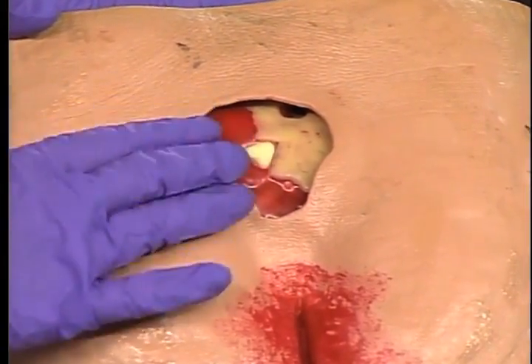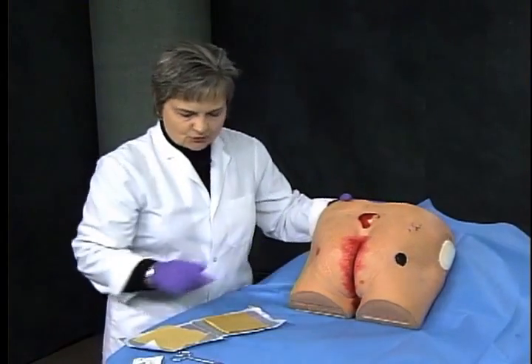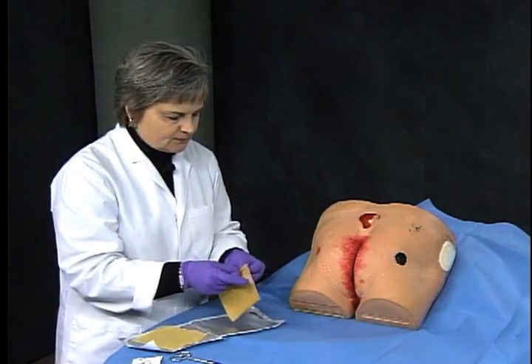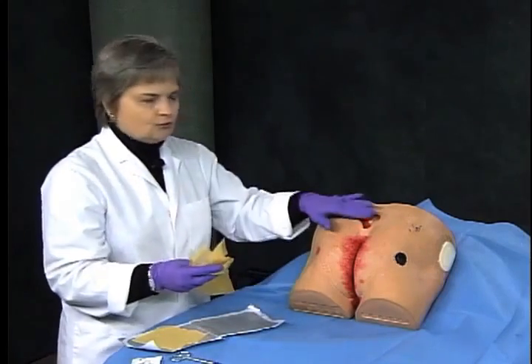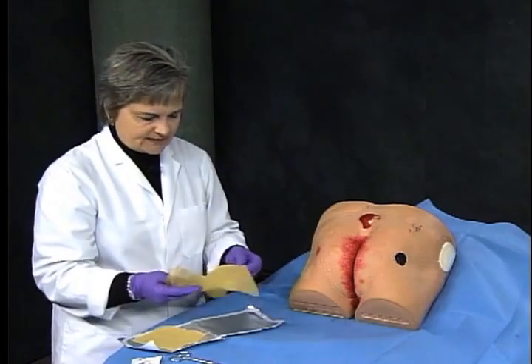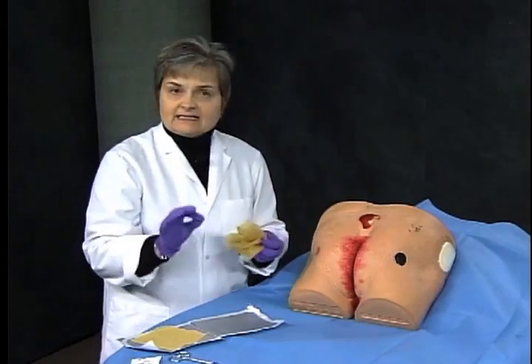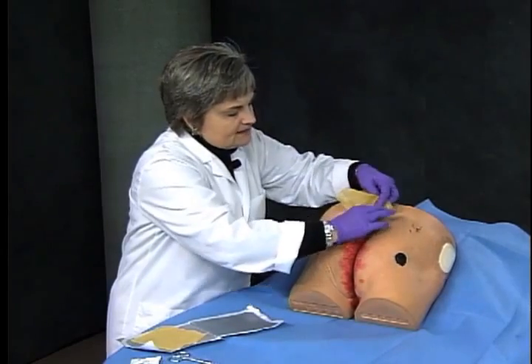Now we are going to want to fluff some wound filler into this wound. So what we're going to do here is use a larger size of the silver dressing. And again, you have to make a judgment of whether you want to moisten the dressing before you apply it into the wound or if the wound drainage is sufficient. Again, if you're ever in doubt, moisten the dressing. In this case, you can either use your gloved finger or a cotton tip applicator, but we are just going to gently advance this dressing down in.